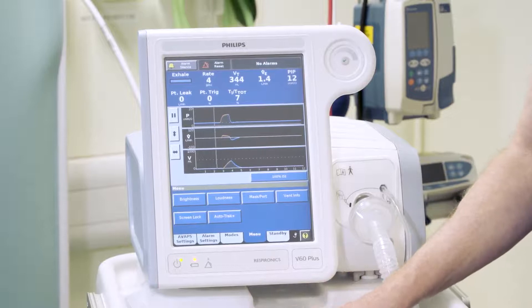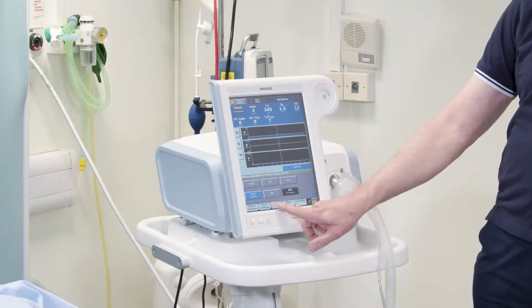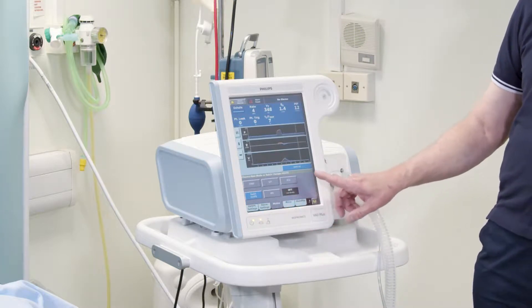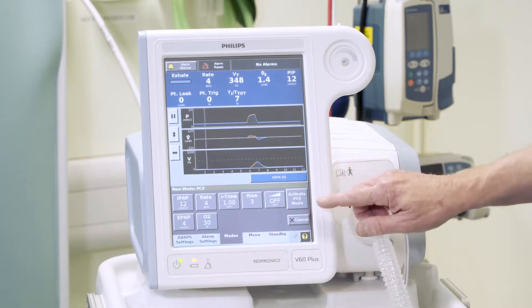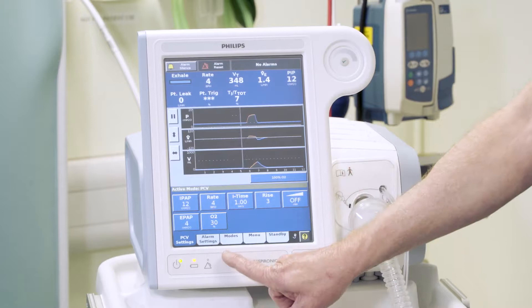In terms of mode settings invasively, if you open the modes it will give you the options of doing pressure controlled ventilation. If I acknowledge that, you can then adjust the settings.